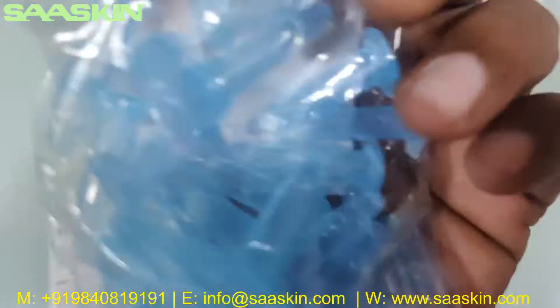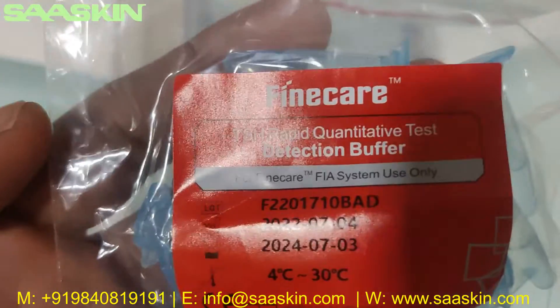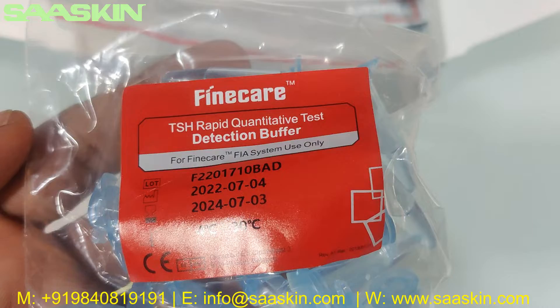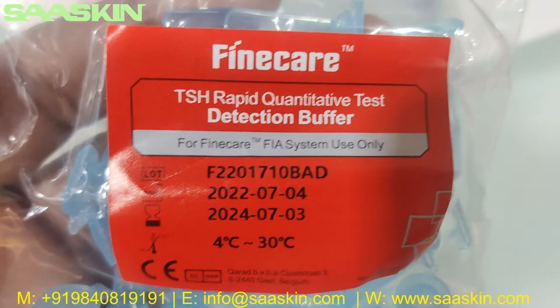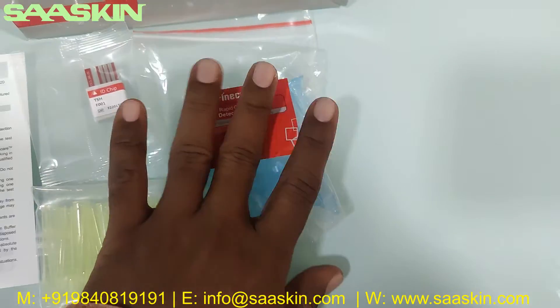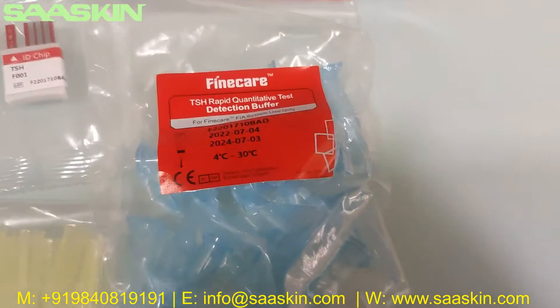The dilution buffers are a light blueish color. You can see this is the TSH Rapid Quantitative Test dilution buffer, with the lot number, expiry period, temperature markings, and a mark on the label. The buffers are individually packed — 25 in total.